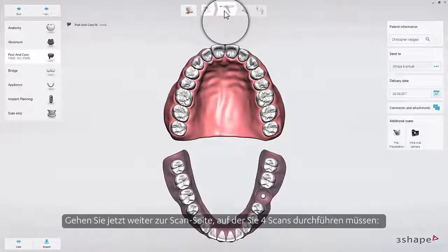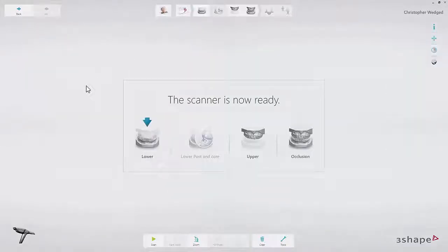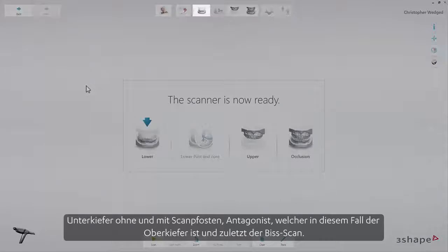Now proceed to the scan page, where you will have to make 4 scans: lower arch without scan posts, lower arch adding scan posts, and antagonist — which is the upper arch in this case — and then the bite scan.